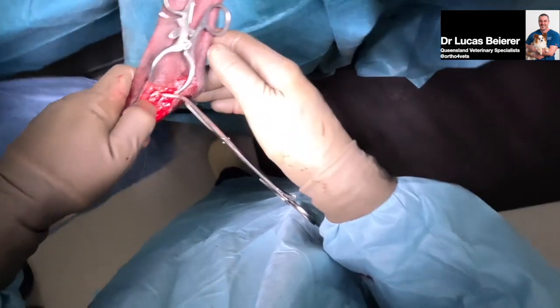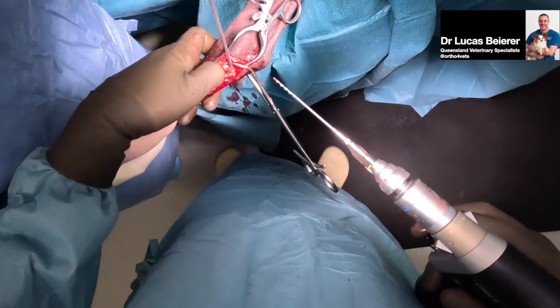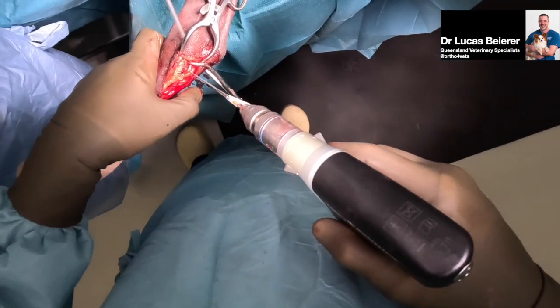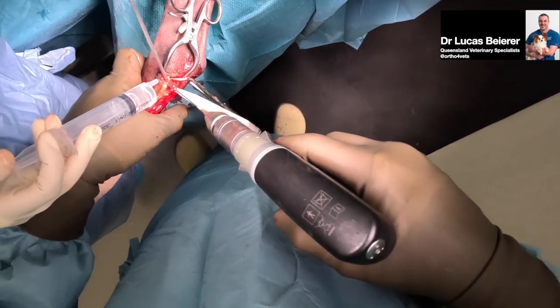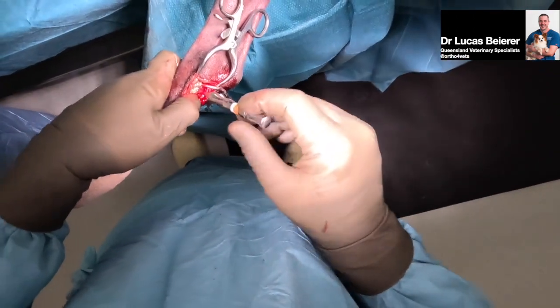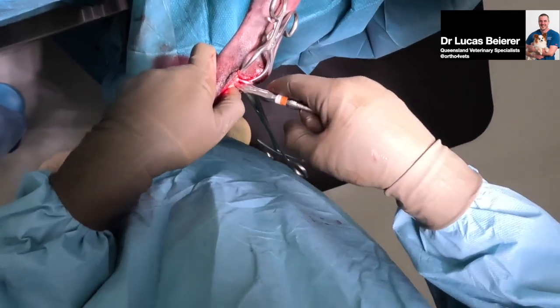So we'll just do a lateral to medial positional screw with a 2mm. Just suction stitch. And this is going to go into the talus. Hopefully that's not too distal in the joint space, but that's the risk. I don't think implants across the joint with this injury is that big a deal. I think it's such a catastrophic injury that there's going to be so much periarticular fibrosis that it gets an ankylosis across these low motion joints anyway.